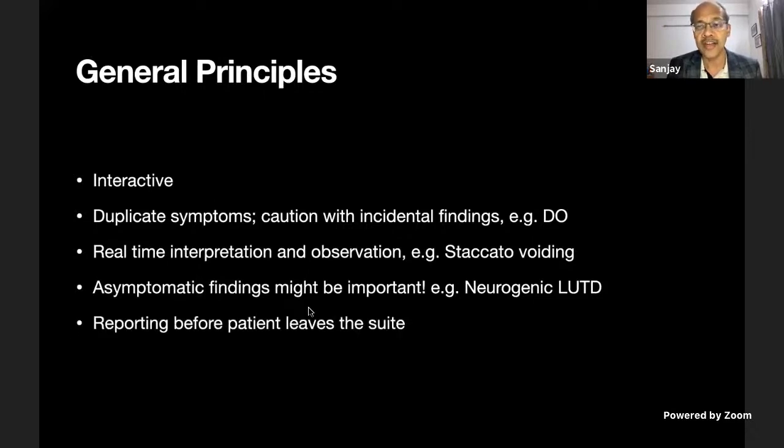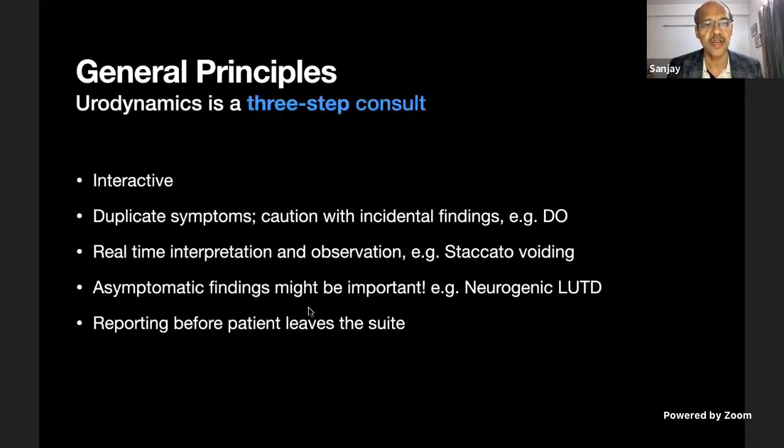You want to report, or at least be prepared with what the report is going to be, before the patient leaves the suite. And as I always say, the urodynamics should not be regarded as a test. It's a three-step consultation process where you first assess the patient, then the urodynamics, and then reassess the patient to give a final answer as to what's to be done next.